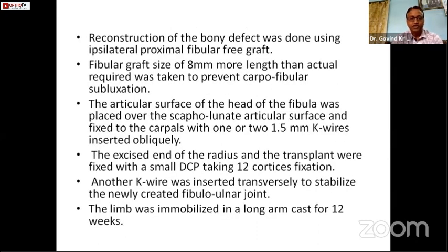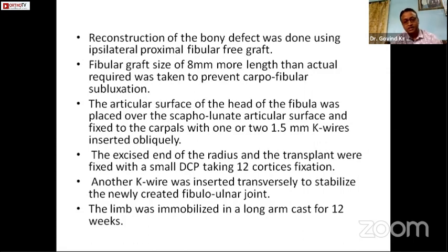Reconstruction of the bony defect was done using an ipsilateral proximal fibular graft. Fibular graft size should be 8 mm more in length than actually required to prevent carpofibular subluxation. The articular surface of the head of the fibula was placed over the scaphoid-lunate articular surface and fixed to the carpals with K-wires. The excised end of the radius and the transplant were fixed with a small DCP plate, and another K-wire was fixed transversely to stabilize the newly created fibuloulnar joint. The limb was immobilized in a long arm cast for 12 weeks.